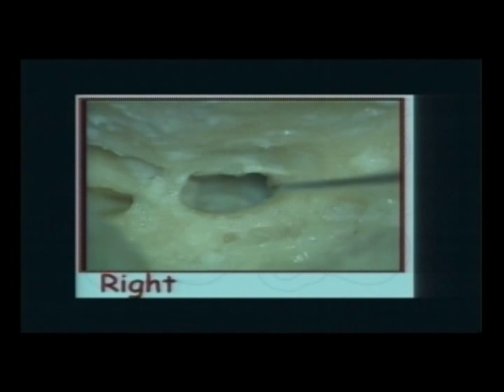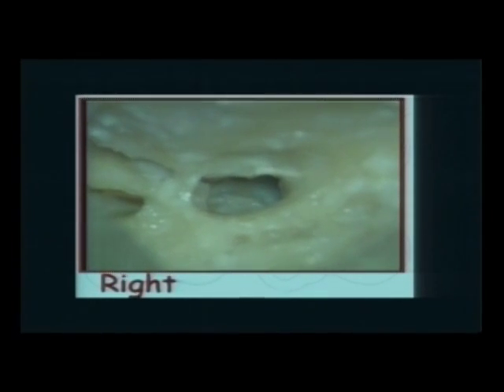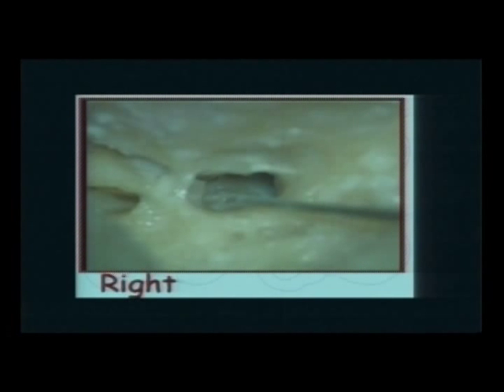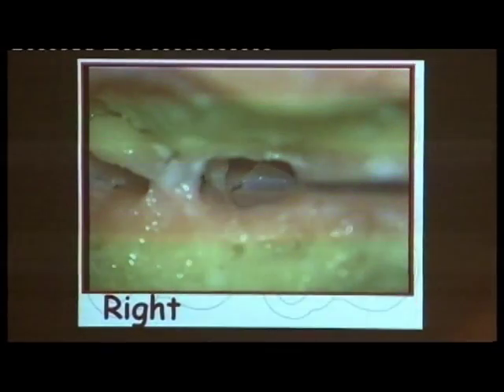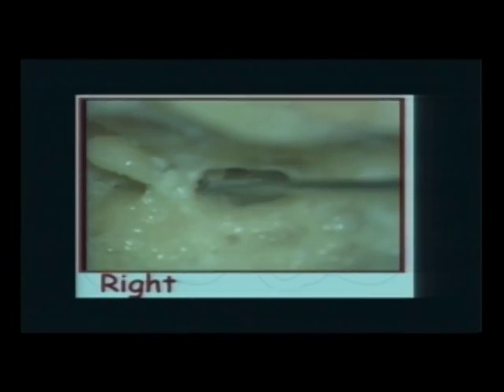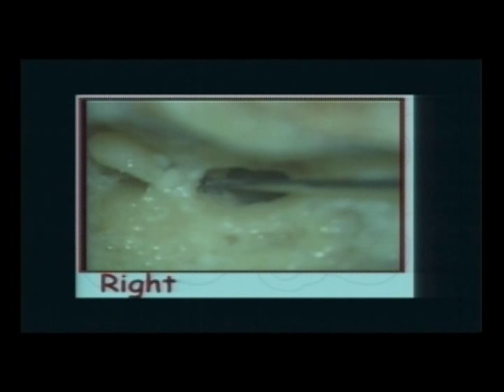Like the posterior canal wall must be very thin. And looking into there, you find sometimes shadows. And so you can't see into the middle ear. Always bring in light. Open up these angles here. Be very careful in this angle because the facial nerve is coming right there. This is the incudostapedial joint right there. And the stapedius, and the head of the stapes, and the pyramid. There's the footplate of the stapes.